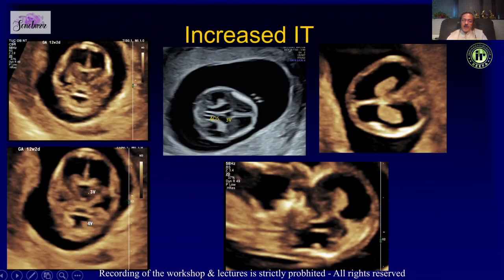We can also rarely see an increase in the size of the IT. If you look very closely in the posterior fossa you can appreciate a cystic structure — this was a case of Dandy-Walker picked up in the first trimester. So an increased IT should prompt you to look out for posterior fossa abnormalities.